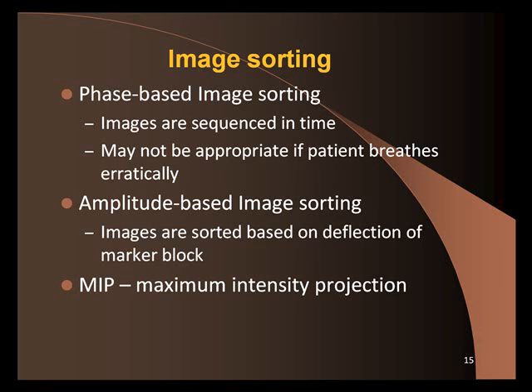Okay, so we're moving in time. So this is the first one, and then in the next slice, the tumor moves up a little bit. The tumor's a little higher. Okay, and then in the next slice, the tumor's up a little higher. Next slice, the tumor's up a little higher. And then the tumor comes down after the patient exhales. The tumor comes down. So this excursion of the tumor can be drawn in an MIP.